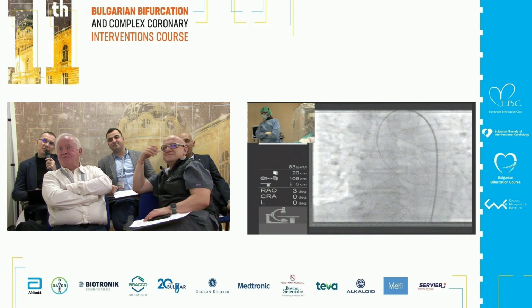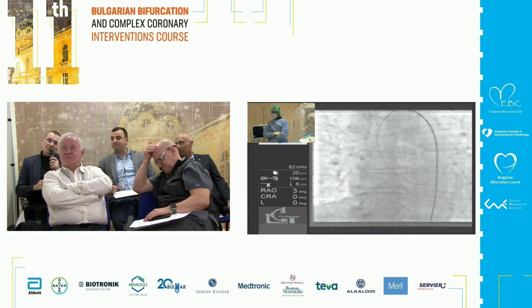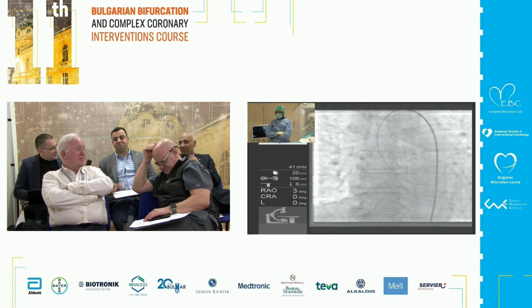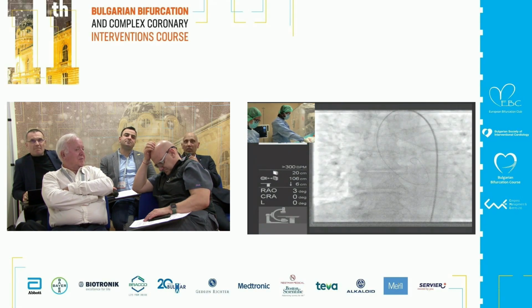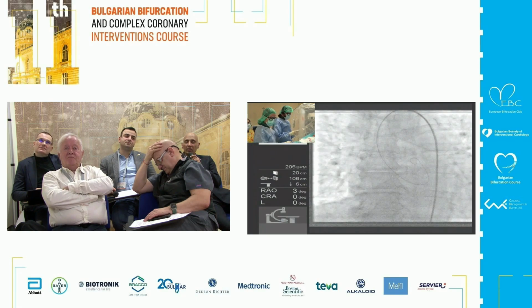this aorta is a little bit horizontal, and I don't know exactly what the angulation is between the left main and the aorta, but from femoral, it's probably better to take a left Judkins. Yeah, I thought somebody would bring that up. Especially for left main, you may want to choose a shorter left Judkins, because then it may not go in all that much. So JL 3.5 may actually work, but EBU should be okay.